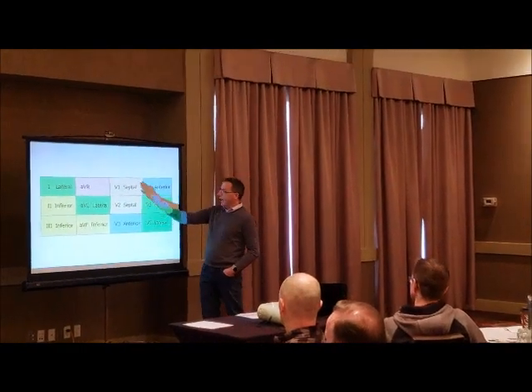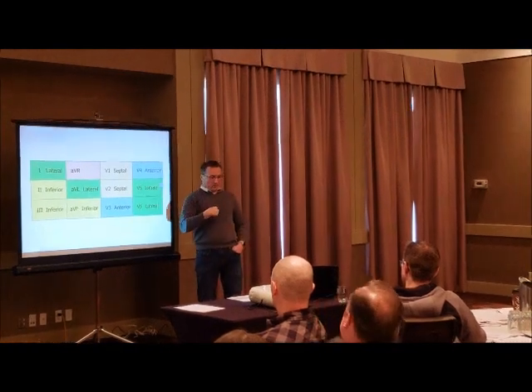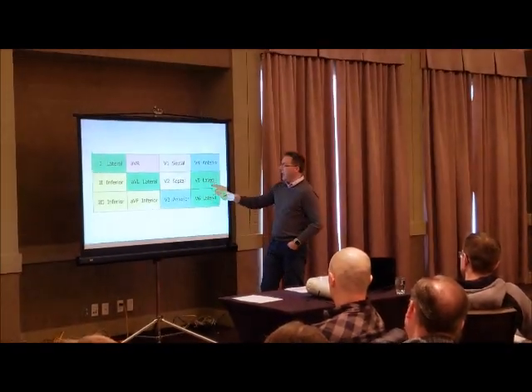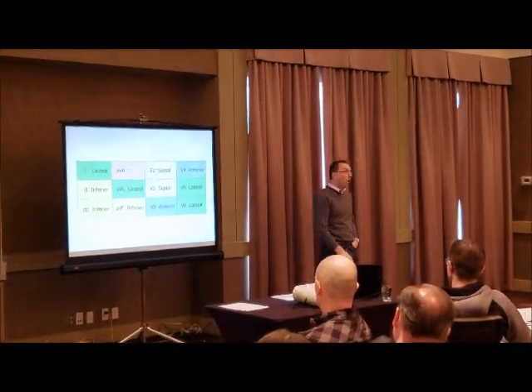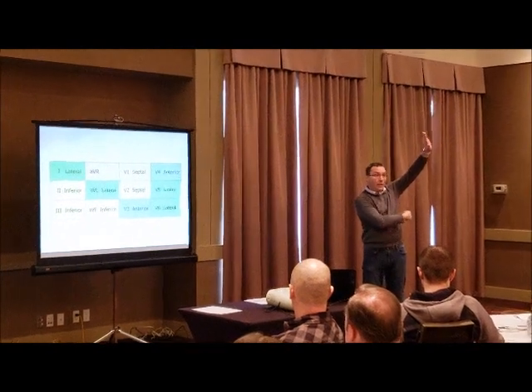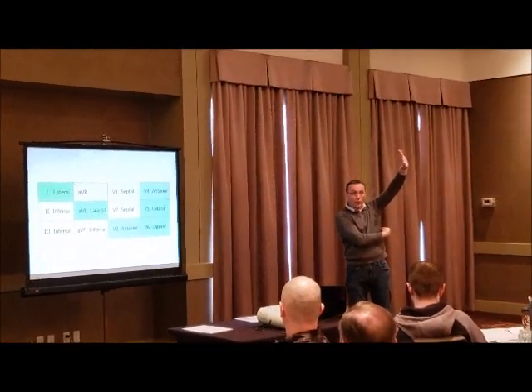Again, septal leads, I usually group them together with leads V3 and V4 because V1, V2, V3, and V4 are on the anterior chest, and then V5, V6, the so-called low lateral leads, low meaning they're down here on the chest, but they are anatomically lateral. You can see that. They're on the patient's lateral chest, so you know they're lateral leads.